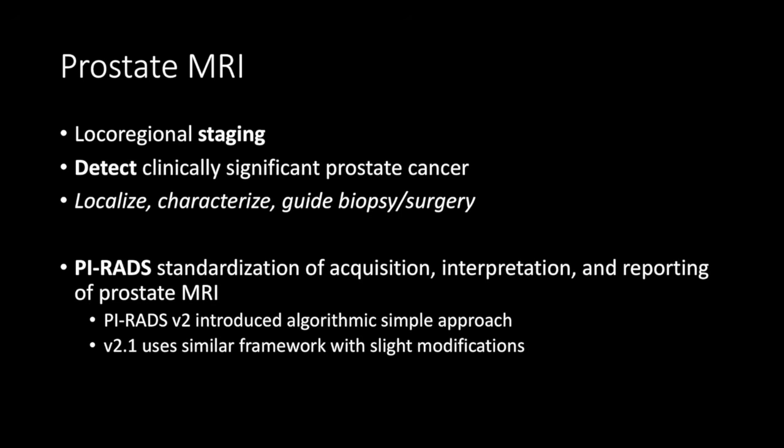But first, what does a typical prostate MRI protocol look like? What images do we acquire, and what images are we looking at when we look at a study?